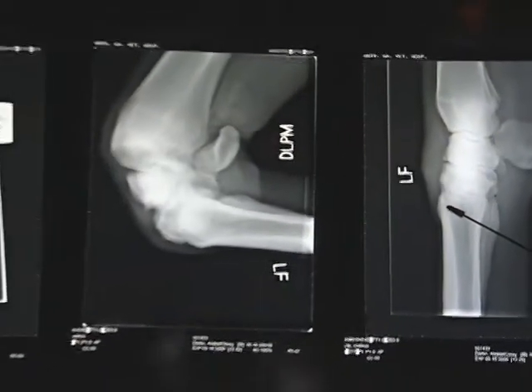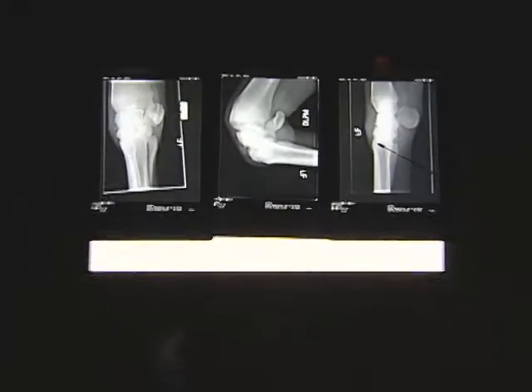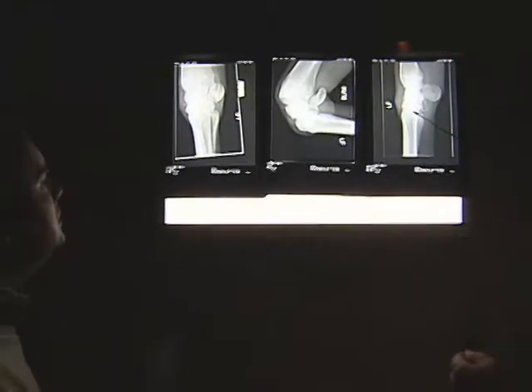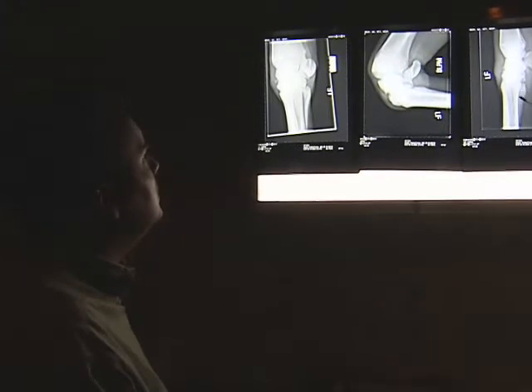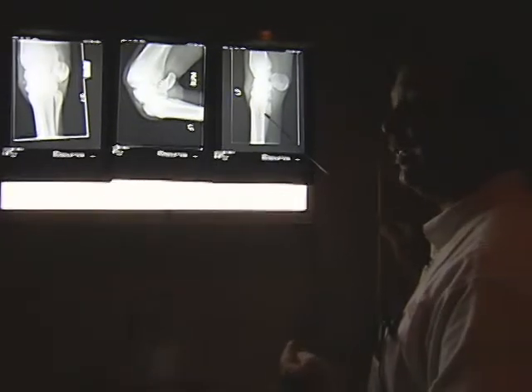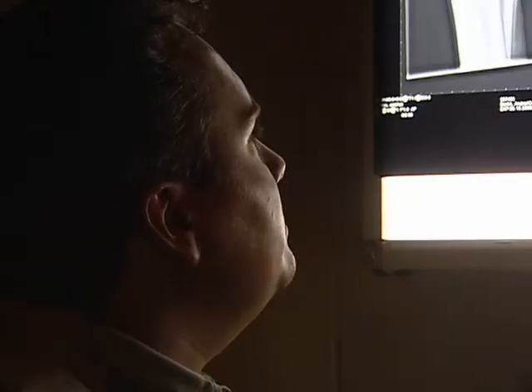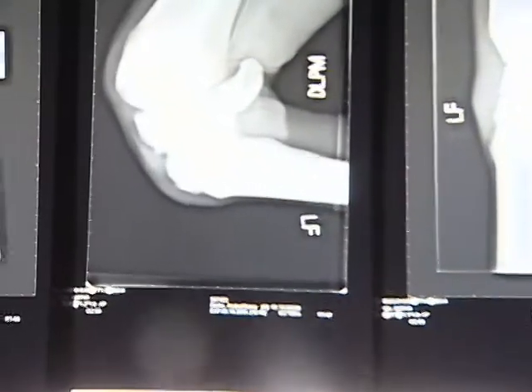So our patient that came up, or the customer that came up, it looks like the referral from the vet, they were right. Something's wrong. Yes, the referring vet did a great job. He isolated the problem to that carpus, and he knew there was something there. And with the x-rays today, showed us what we've got to do, and we're going to have to go in there and clean this joint up. So I guess our next step, Dr. Mike, is to go ahead and get Corey ready for surgery. It sure is. Our next step is to get him into surgery and get that joint opened up where we can see if we can find this problem and remove it from the horse.